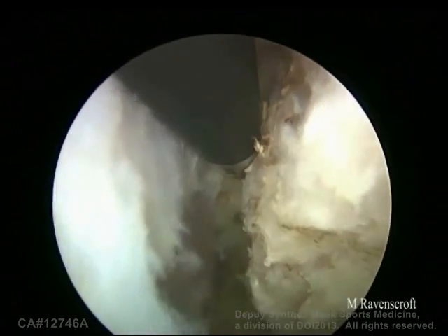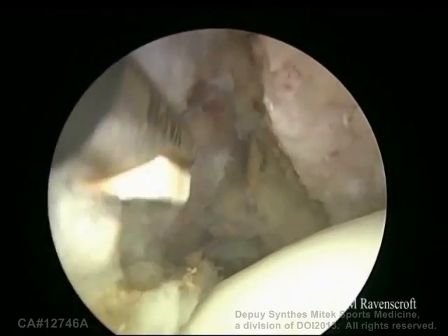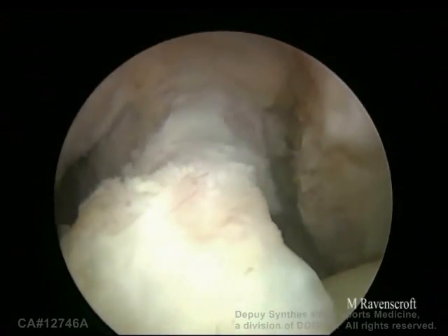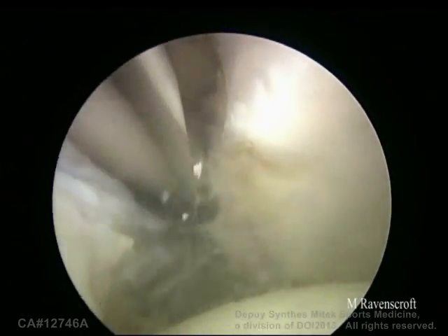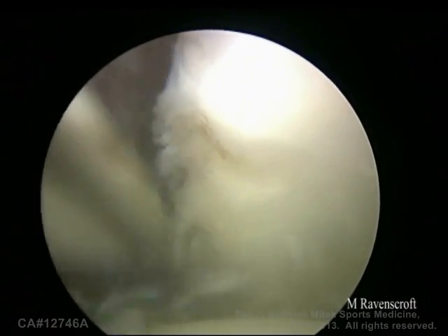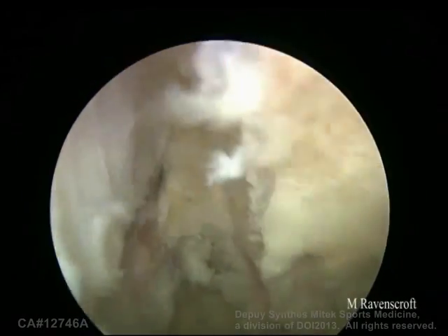So now back onto the glenoid neck preparation. Again viewing through the D port, working through the E port. Clear away this tissue here because it will again get in your way when you do your subscap split. Then bring in a burr to create the bed for the graft. You want a nice bleeding bed that's quite flat. Once you've finished burring you should be able to see the glenoid bed area.